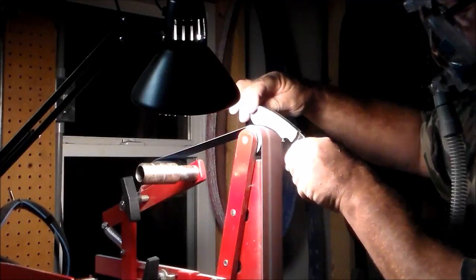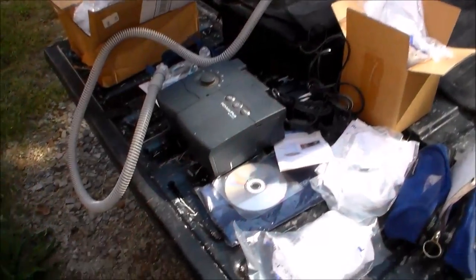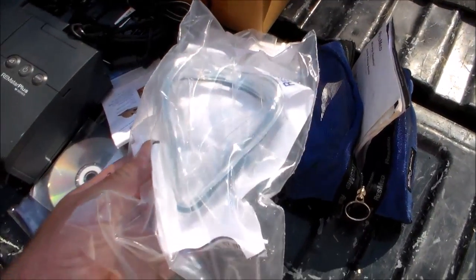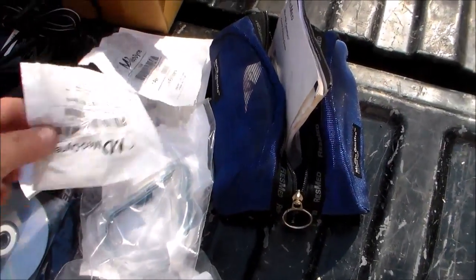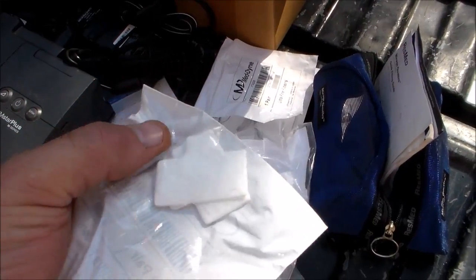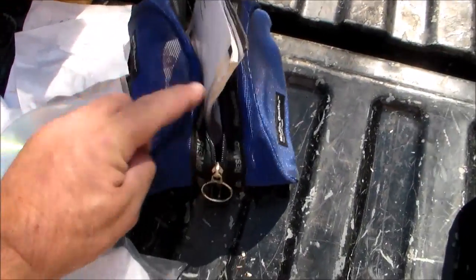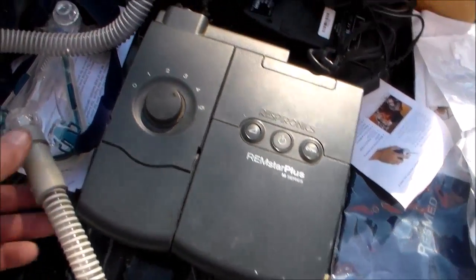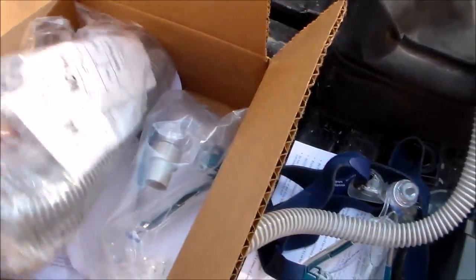I bet you could find one on Craigslist, or maybe you know somebody whose insurance replaced it with a newer model. Here's what I'm starting with: lots of parts, extra seals for the mask, a bunch of micro-fine filters, a DVD with instructions, a couple bags of stuff, the actual CPAP machine, complete masking hose, extra hoses, and a complete extra mask.